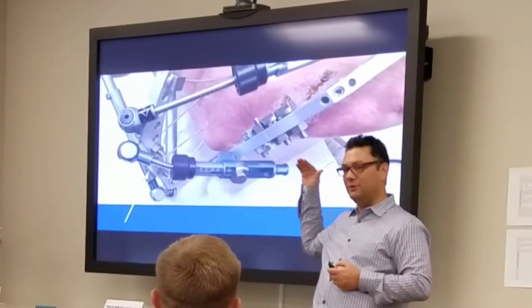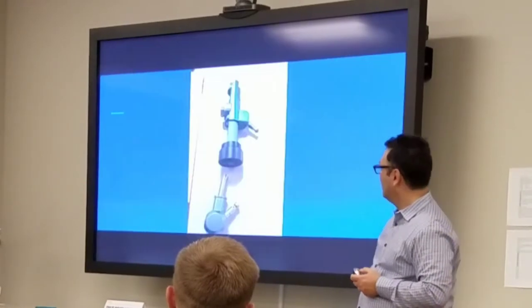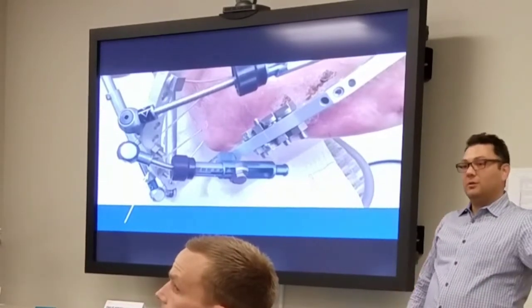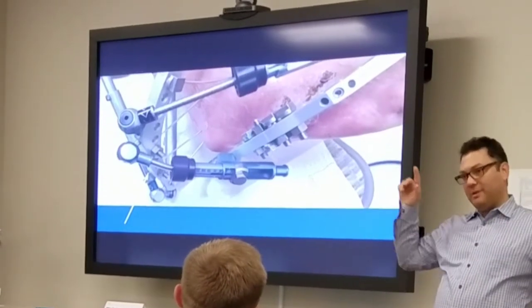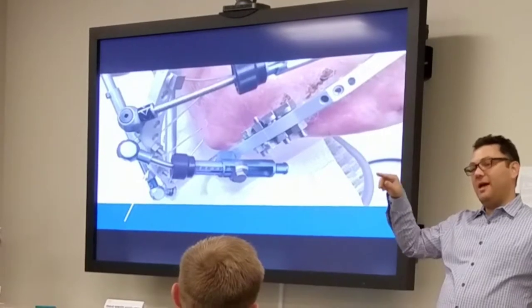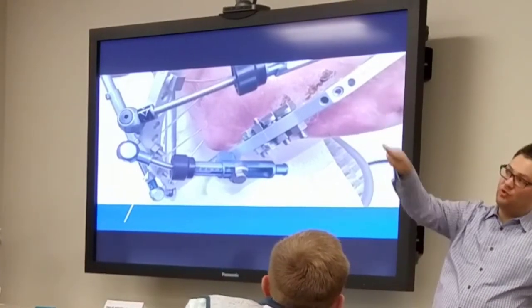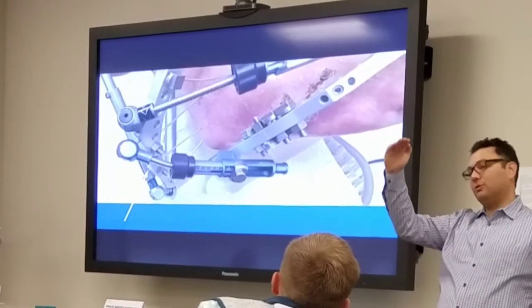I find that fixating that medial column, if it's that extreme, I rotate them when I take it off. I mean, not necessarily from a fusion standpoint, but from a triangulation standpoint, to lock your rear foot in with your forefoot. So the way I'm locking it is first met through the talus, and then fourth met into the calcaneus. Once I create two parts of the triangle, that subtalar joint's not really moving.